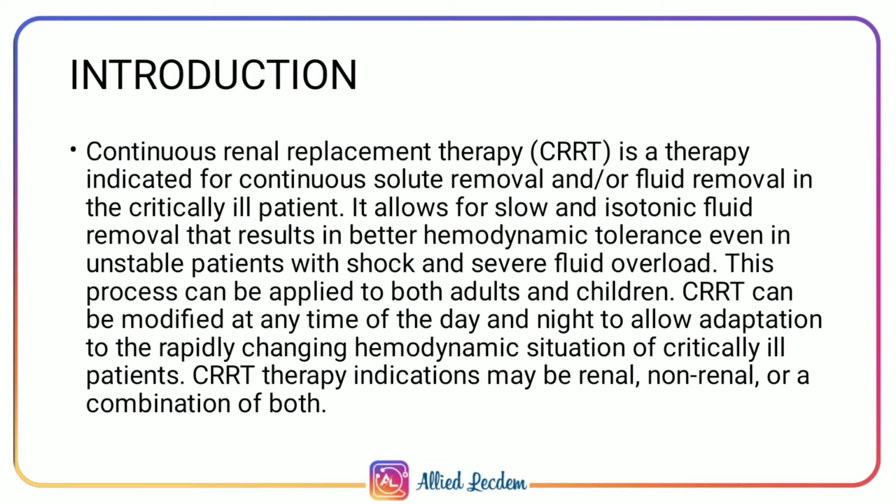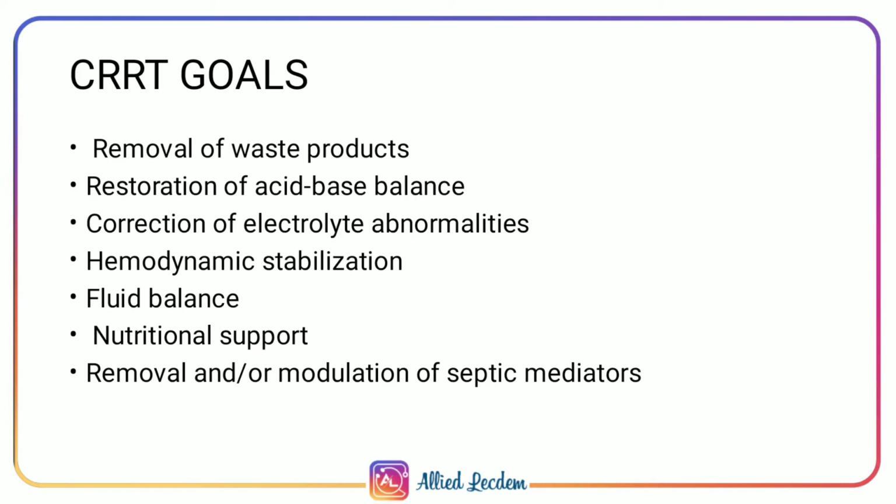CRRT can be modified at any time of the day and night to allow the adaptation to the rapidly changing hemodynamic situation of critically ill patients. CRRT therapy indications may be renal, non-renal or a combination of both. The goals of CRRT are removal of waste products, restoration of acid-base balance, correction of electrolyte abnormalities, hemodynamic stabilization, fluid balance, nutritional support, and removal or modulation of septic mediators.